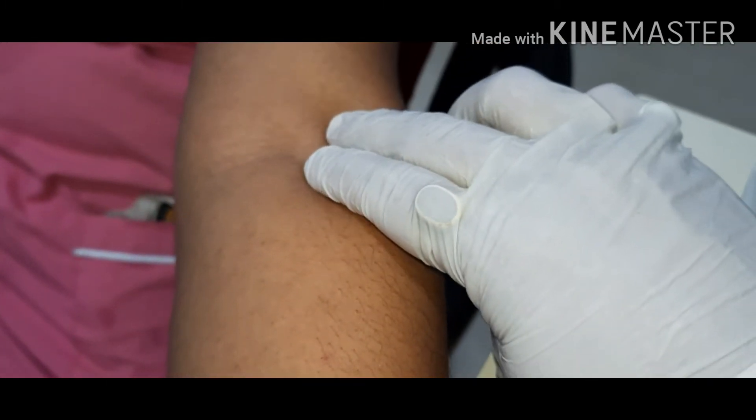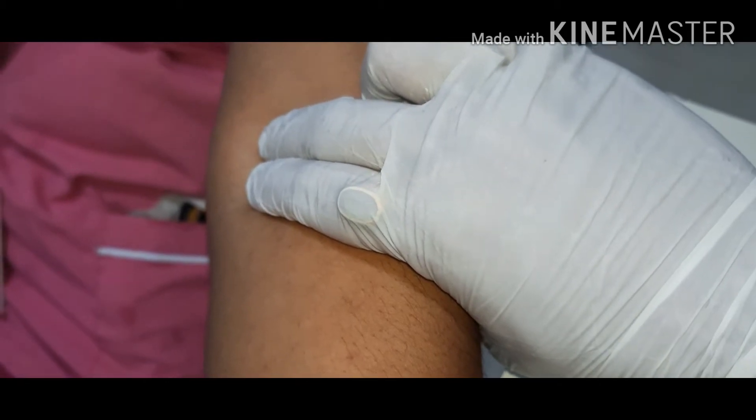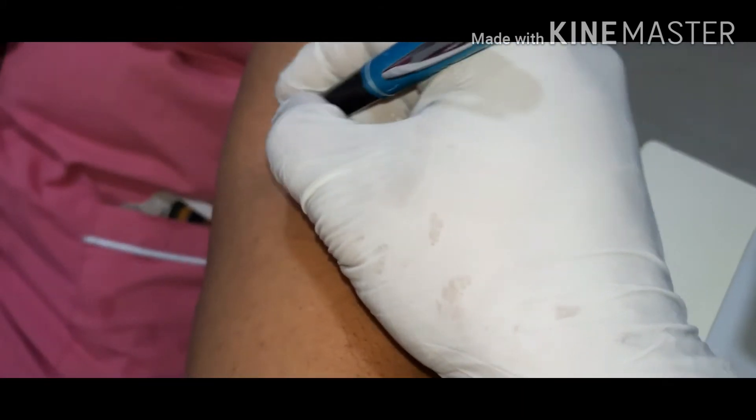Now, first of all, we will feel the pulsation, and if you are a beginner, you can mark it with a pen or a marker.